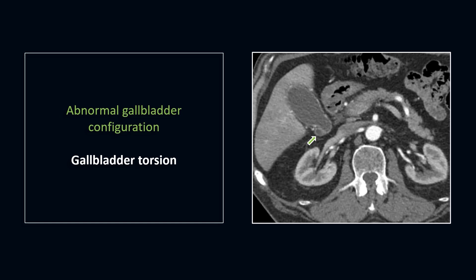Gallbladder torsion is a very rare cause of acute abdomen. It is mainly seen in elderly women and occurs in patients with an anatomic variation of gallbladder fixation to the liver. Symptoms are nonspecific and include acute onset of abdominal pain, nausea, and vomiting. The absence of gallstones in a gallbladder with signs of cholecystitis can suggest torsion. Besides an abnormal location of the gallbladder, a swirl sign of the cystic duct can be seen on CT images. The gallbladder will be more distended in torsion than in normal acute cholecystitis, and treatment is emergency cholecystectomy.